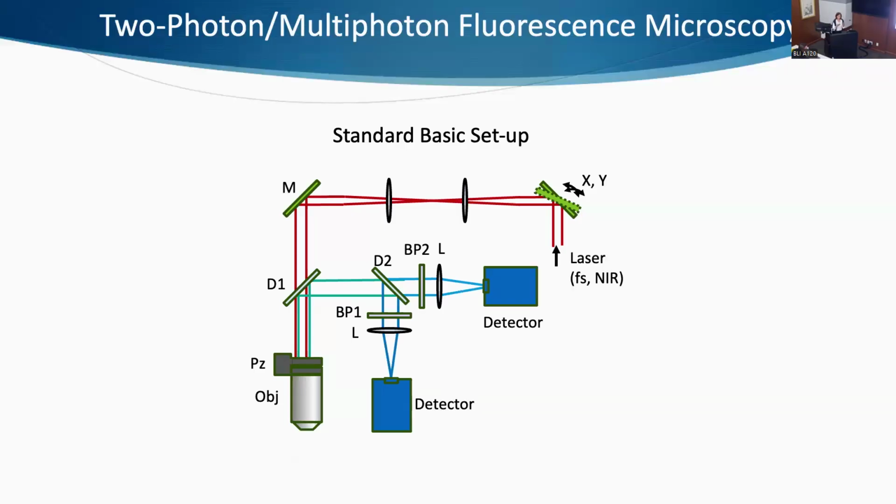Because you have a pair. You usually pick a point in between, and then you'll have some motion at the back aperture of the objective, and that creates some vignetting. It shrinks a bit your field of view.